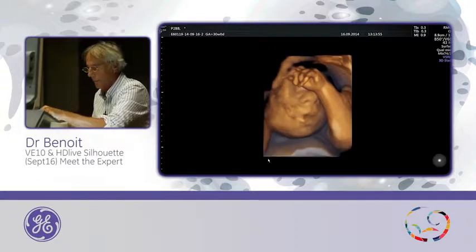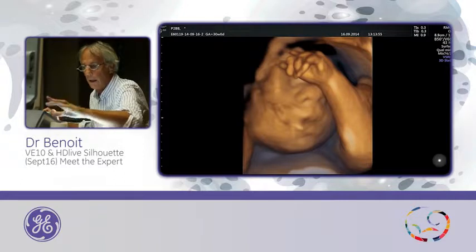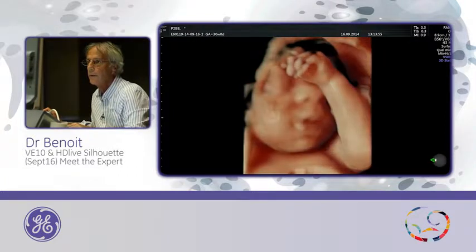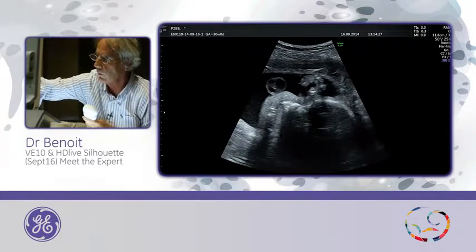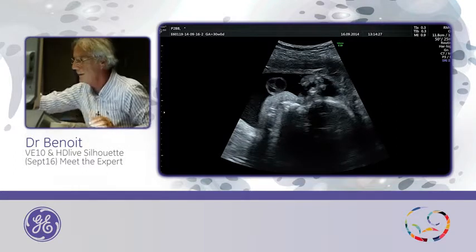Don't cut a finger. It's okay. And HD Live, or this one, move the position of the light. And it's okay. So now I will open some cases.